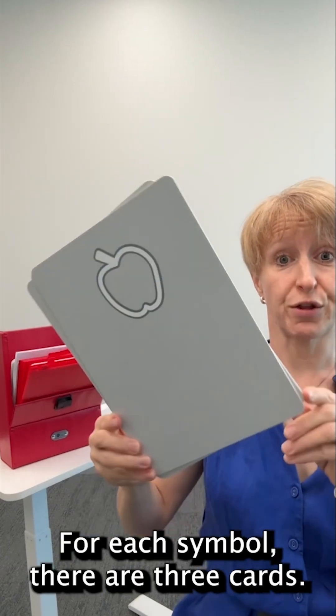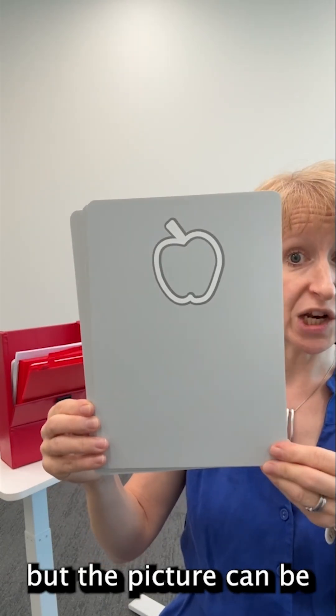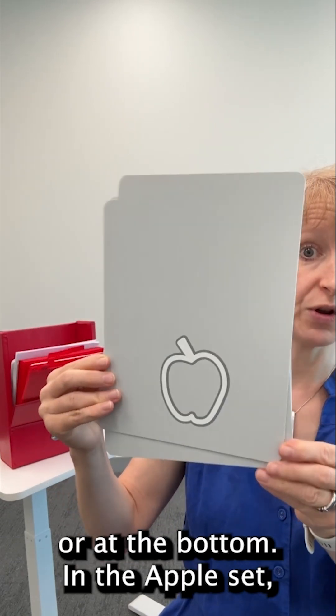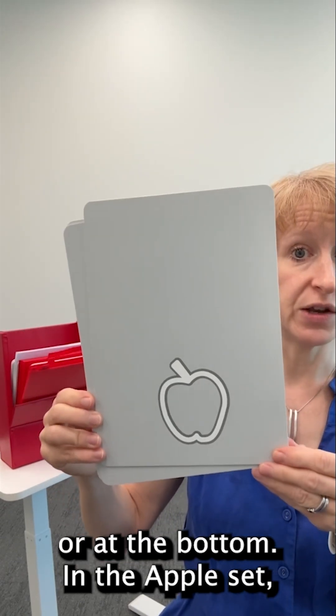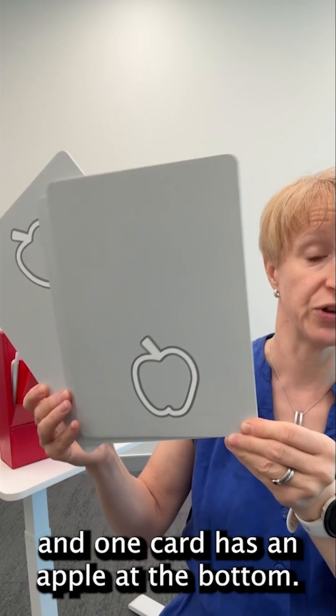For each symbol there are three cards. Each card has the same picture, but the picture can be located either at the top of the card or at the bottom. In the apple set, two cards have apples at the top and one card has an apple at the bottom.